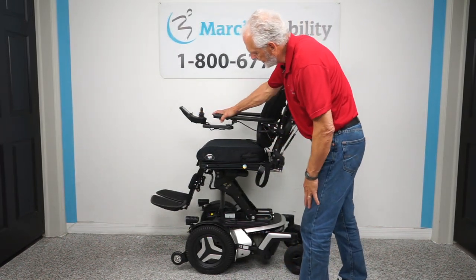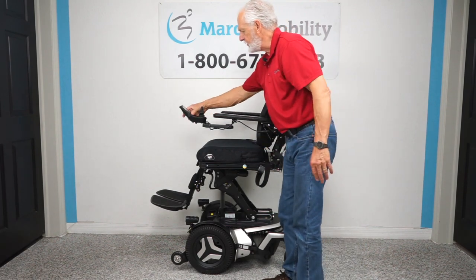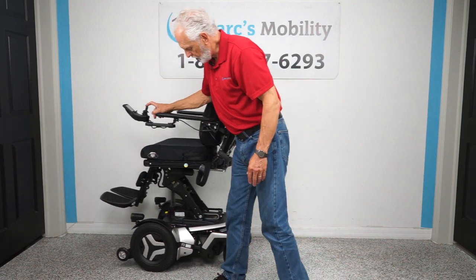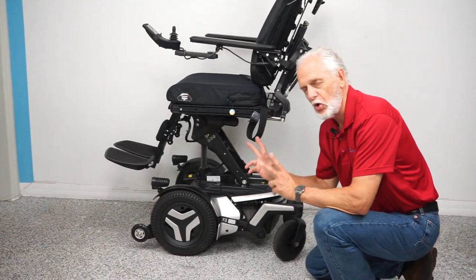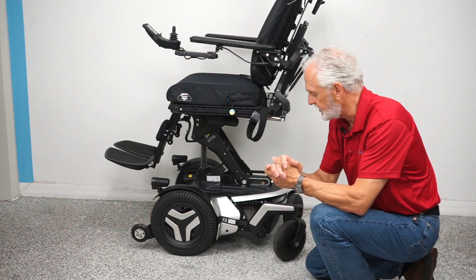Now we are elevated all the way to the top. The nice thing about this chair is it will still drive with the seat elevated at a really good speed. While we have the seat elevated, let's look at the base. You can see how sharp this is. This is a Permobil — the highest quality power chair you can buy in the industry.